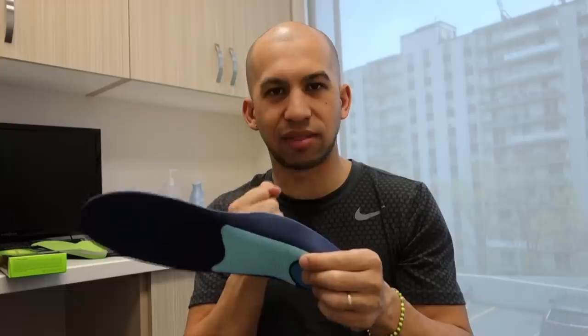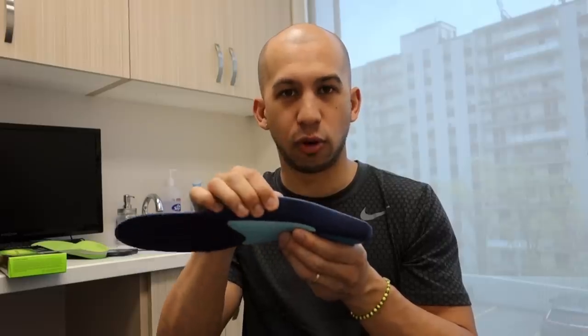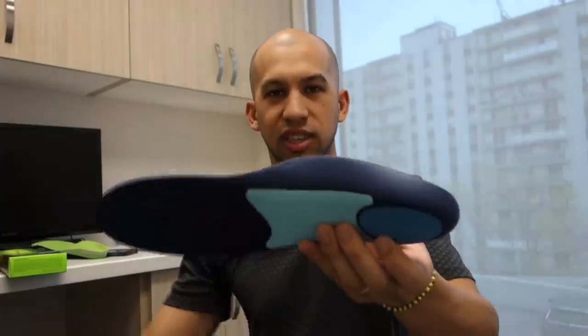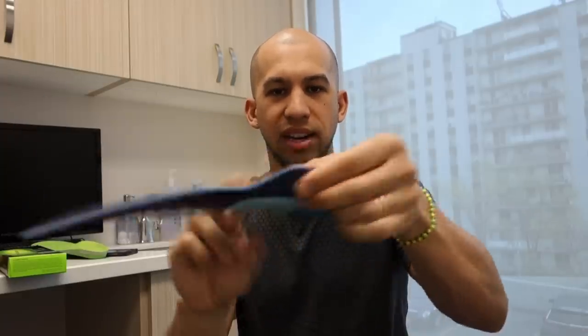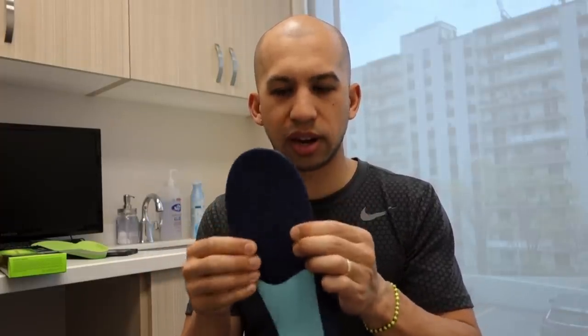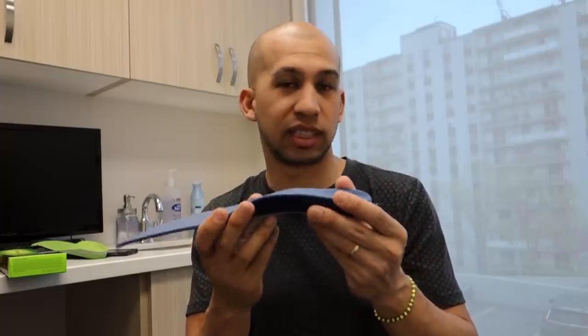It can still bend in the middle so it doesn't have a lot of hold, but there is more material in your arch. Because there's more material in the arch — this gel, foam, and plastic — that reduces the amount of compression, so your arch is going to lower less. By the foot rolling over less, that reduces some of the movement you're experiencing, and by removing some of that motion we reduce the stress on the tissue. This one has a lot more hold or support than the first one. It also has nice soft foam forefoot padding and a soft heel.